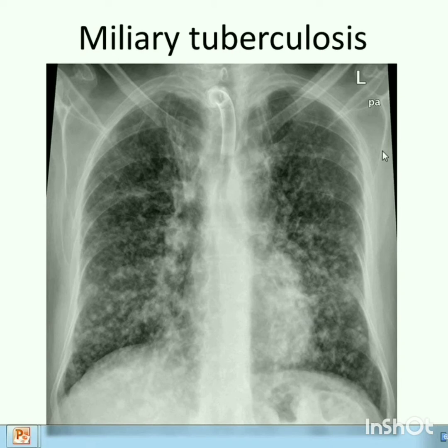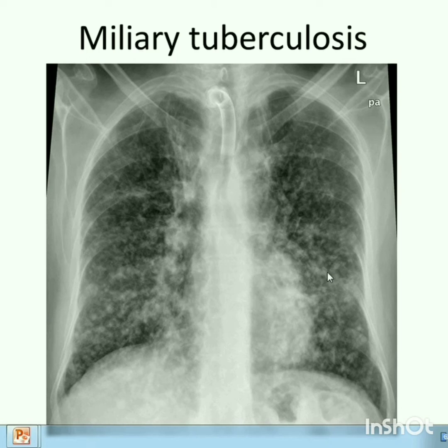Plain x-ray of chest in PA view showing bilateral evenly distributed small 1-2 mm nodules with basal predominance. So it is miliary TB.